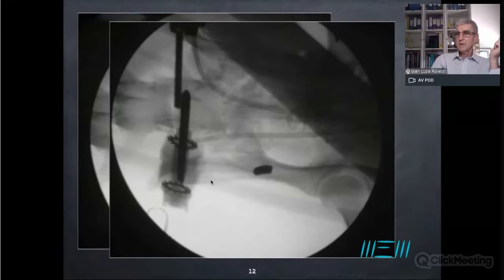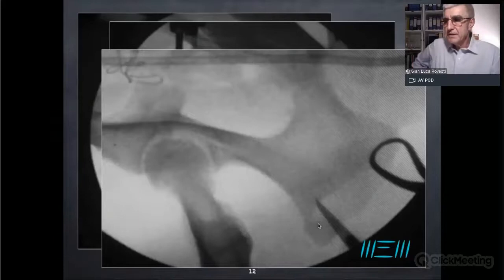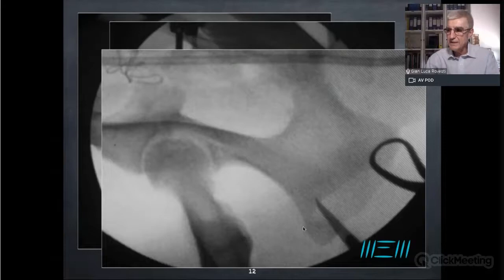And then this is a scalpel blade, so a small stab incision, and then I will prepare this area exactly as for any other external fixation. Meaning with a mosquito, I'm opening this area through soft tissues, and I will prepare this area of the ischial tuberosity to insert the threaded pin through it, okay?